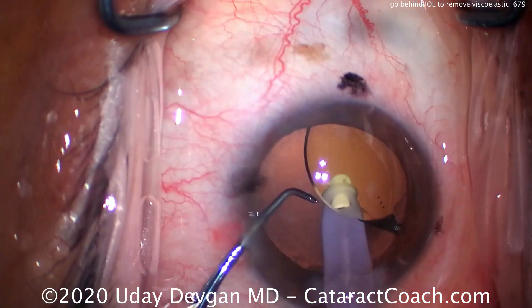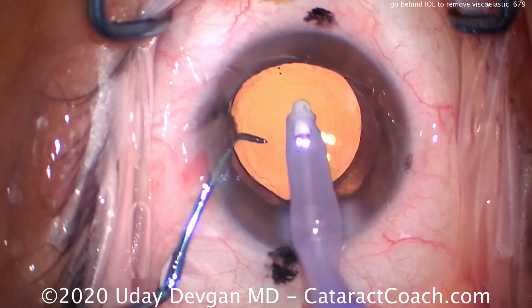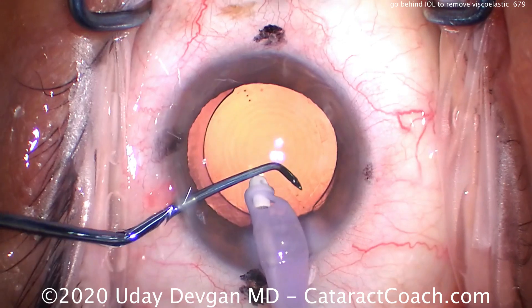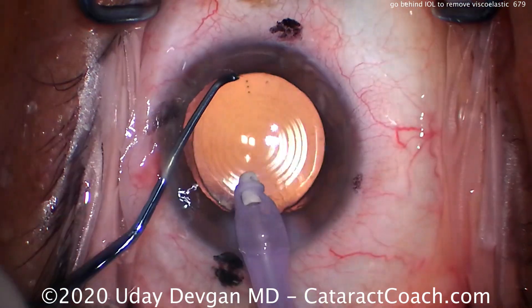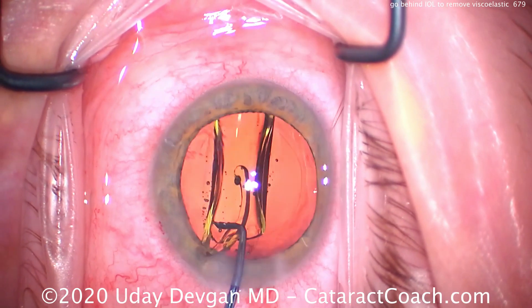If you're doing a monofocal lens, it's not quite as critical, though you may still have issues with IOP spikes right after surgery. This maneuver does take some practice — you're shifting the IOL within the capsule bag, and remember you're lifting the IOL up towards the corneal apex. Let's show one more video of going behind the IOL.